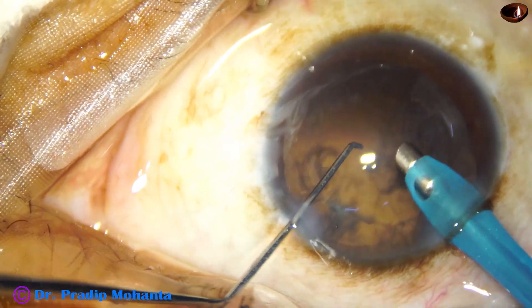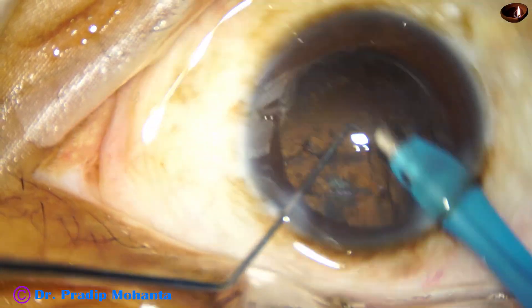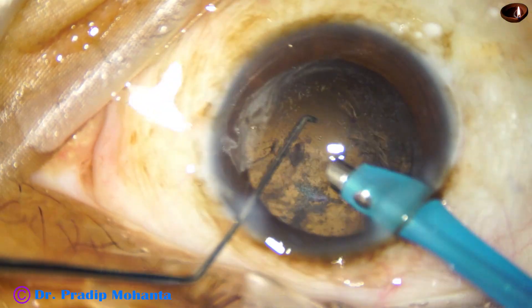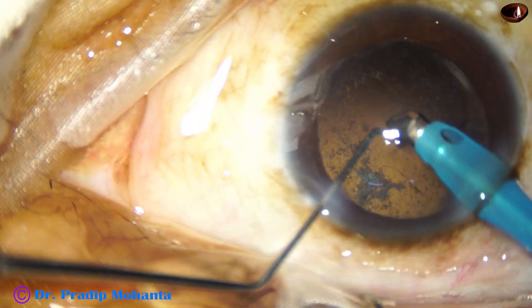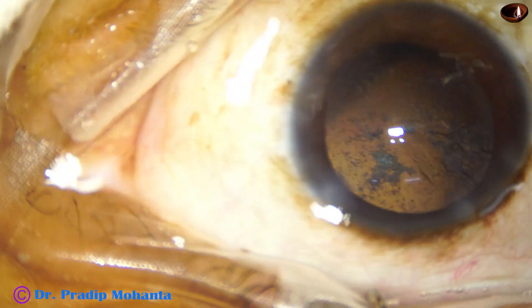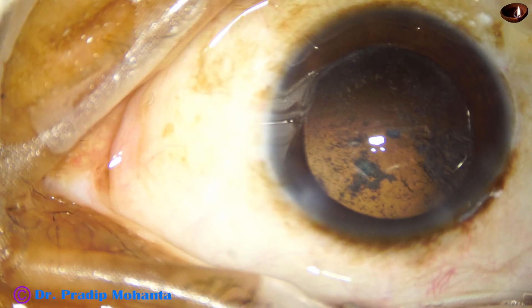And now this is the last portion. I always try to remove some cortex with the handpiece itself, and I take care of the posterior capsule. Whenever I consciously do this with full concentration, I don't get a rent. I get rents in usual routine cases where I don't expect a rent.